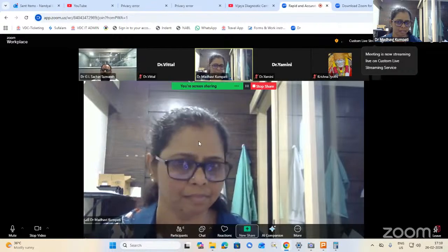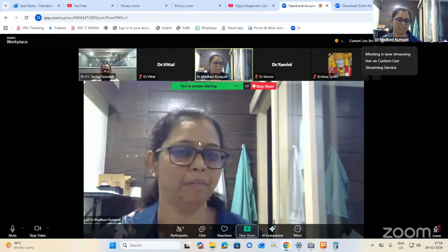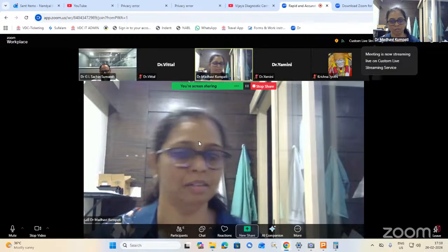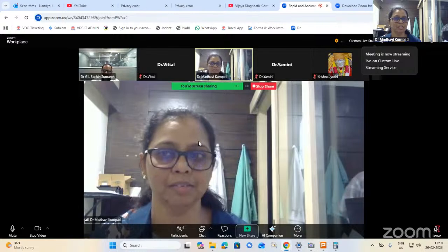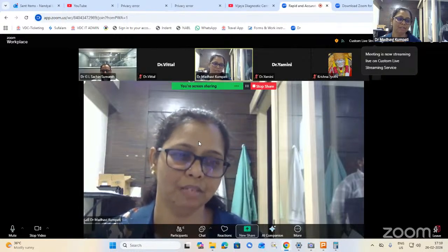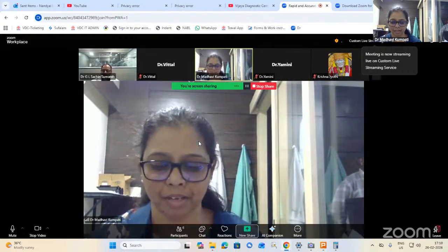And I'm sure one more challenge that we face with respect to blood cultures is we don't get a paired blood culture, right? Yeah, exactly. By paired blood cultures, I mean an anaerobic and an aerobic blood culture, which we rarely get, especially because we are not a part of a hospital. So we rarely get these kind of samples. If the clinicians could actually insist on sending an anaerobic and an aerobic blood culture, it would be really helpful for us.